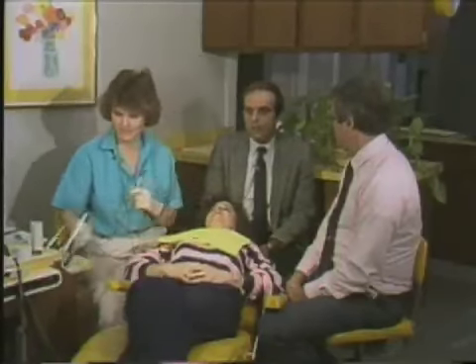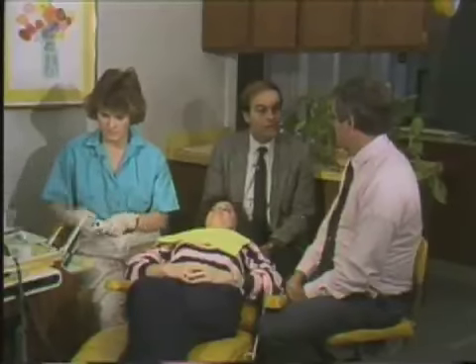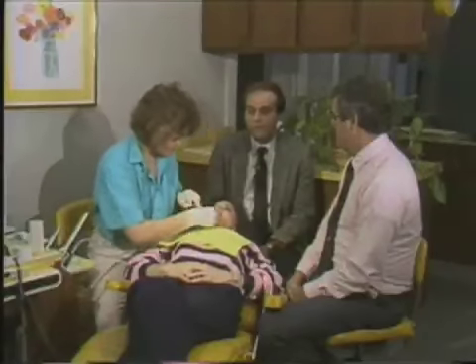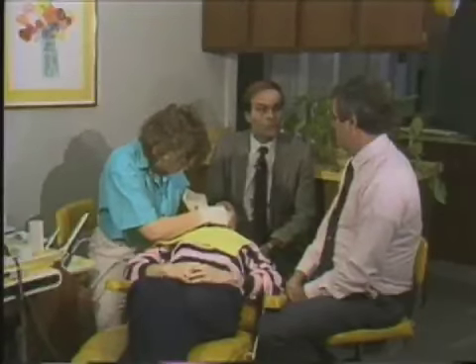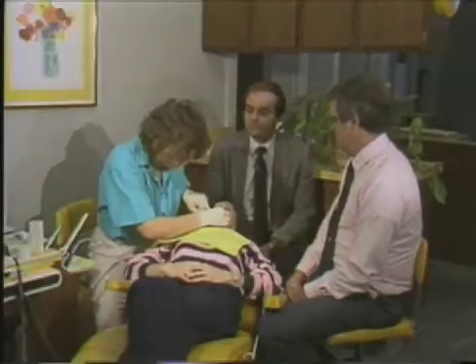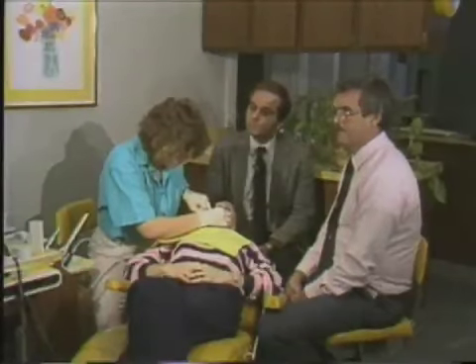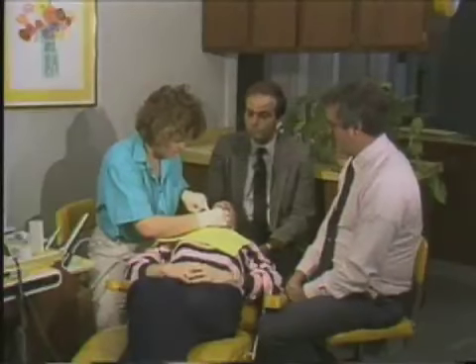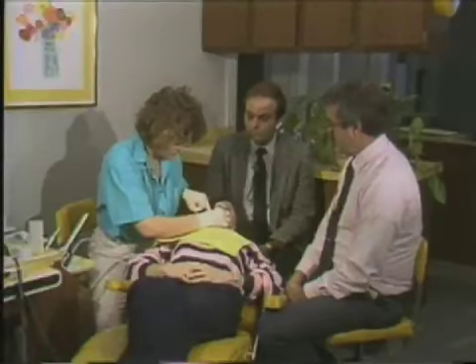The brush in some cases will remove it, and even in other cases it won't remove it. In that instance, scaling is what's required. But as long as the prophy is done with a rotary instrument, either a rubber cup or a brush, should be more than adequate to get the job done. Okay. Now Liz is going in the contacts to make sure that the contacts are clean and that there's no pumice left in between the teeth.